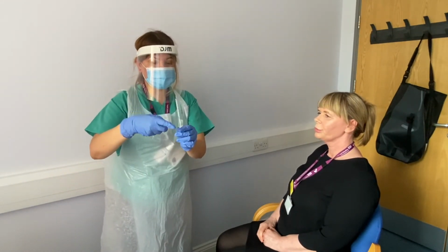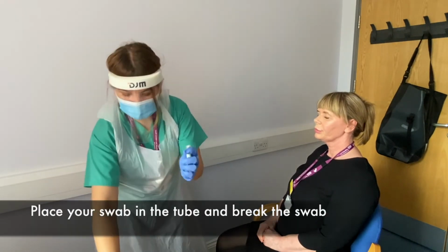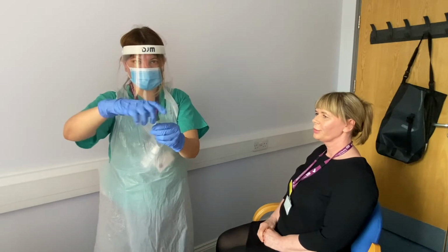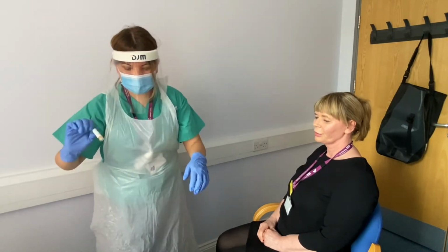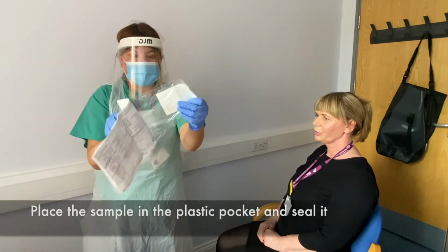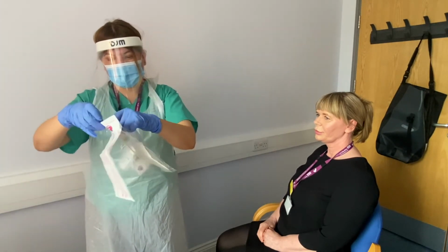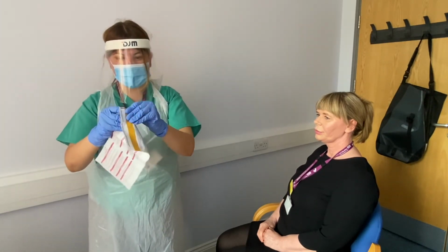You put the swab inside and you break it in half. Okay, and then you place it in your form. You will see that you have a pocket here, and you will seal it.